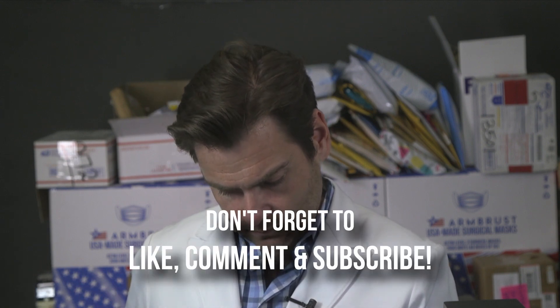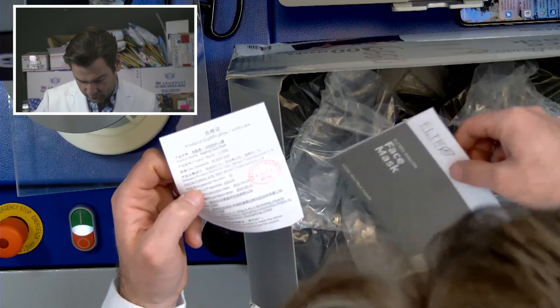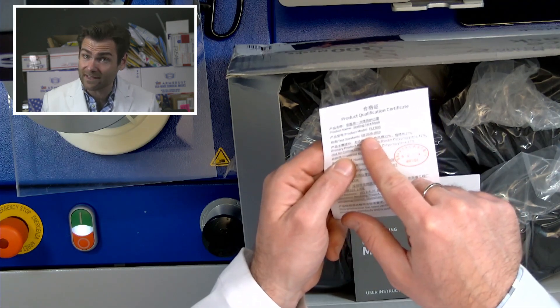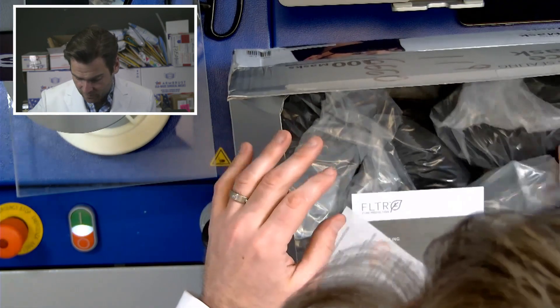Some crazy person sent me an entire box of the Filtrete KN95 masks. This is Costco's brand. What's weird is they don't say KN95 on the box — they say 'Filtrete 95' — but the test standard listed is GB2626-2019, which is the same thing, and that's what this machine is designed to test.